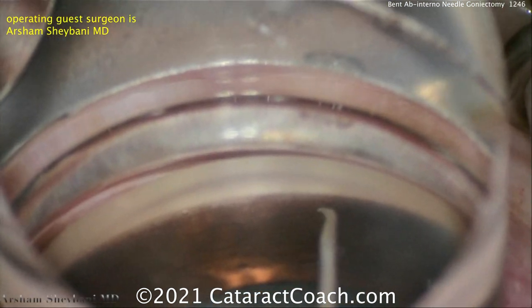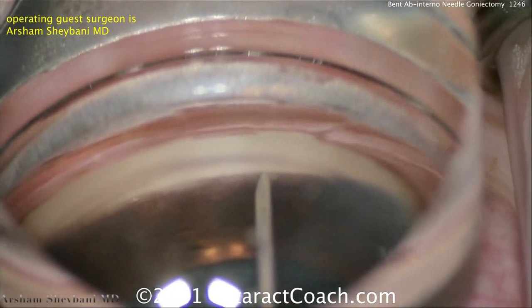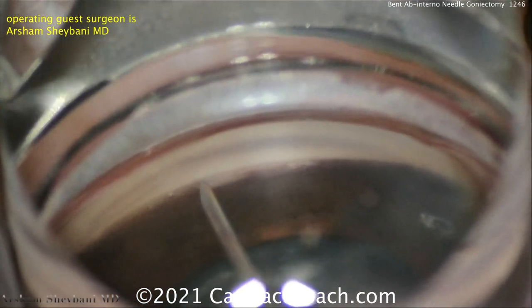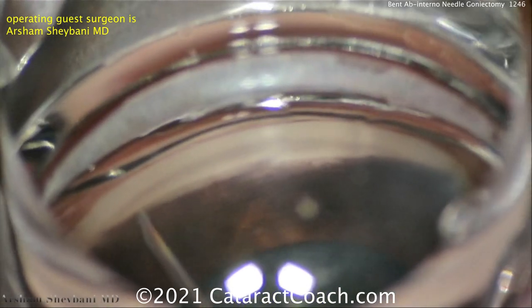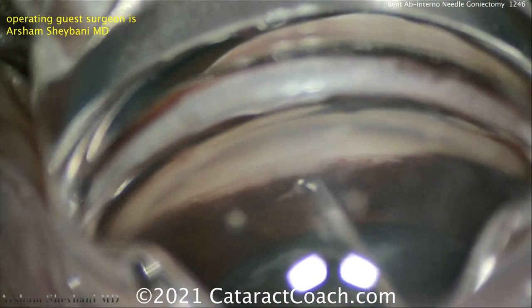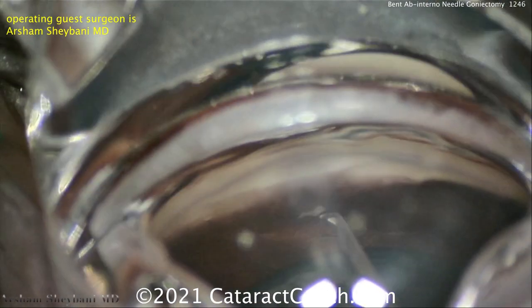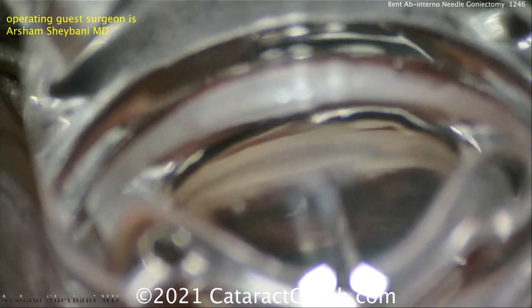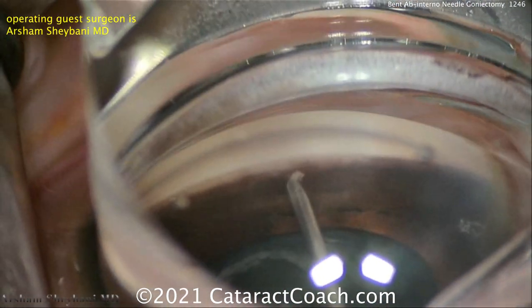Now going in to the angle — it cuts very beautifully. You want to have about 90 to 100 degrees of cut. Starting on the right side, holding the gonio prism and coming across to the left. This is Arsham Shabani's technique — he is brilliant. He developed this and it is ultra low cost. You can see there's that strip of trabecular meshwork that was removed, and now you can flip the needle the other direction to widen this up to about 90 to 100 degrees.